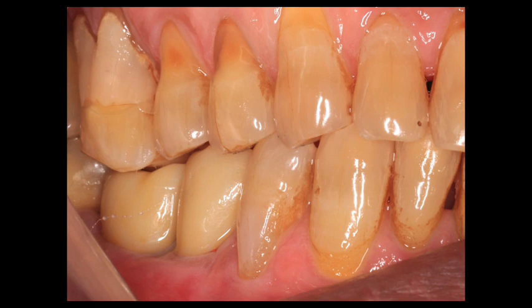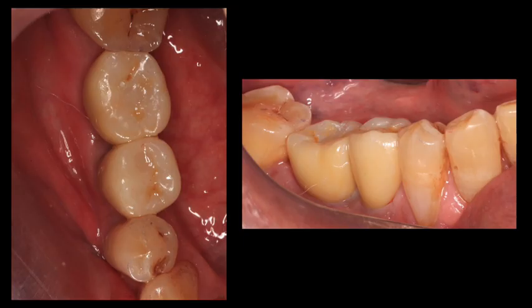And that's how the crown looks right now. The patient of course needs a little tooth wear management and some stains still need to be worked on, but this is how the workflow goes. Thank you.